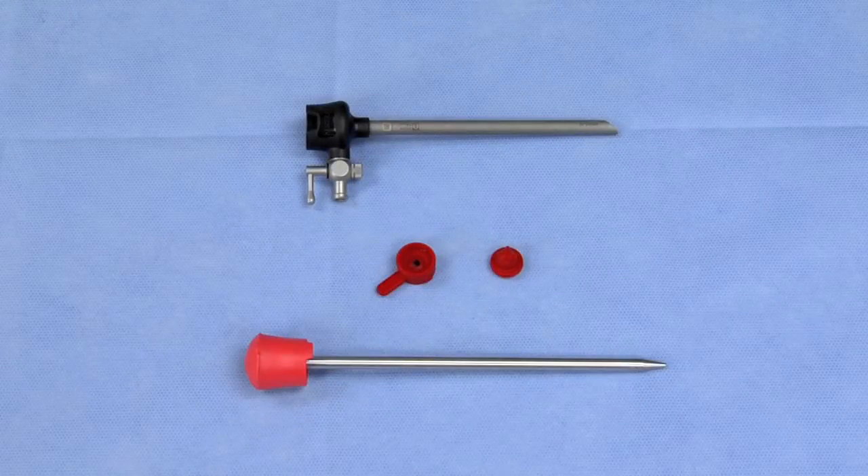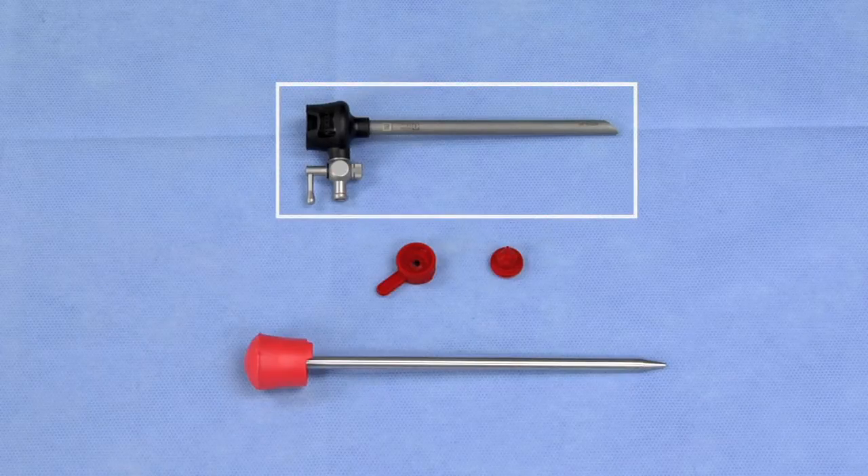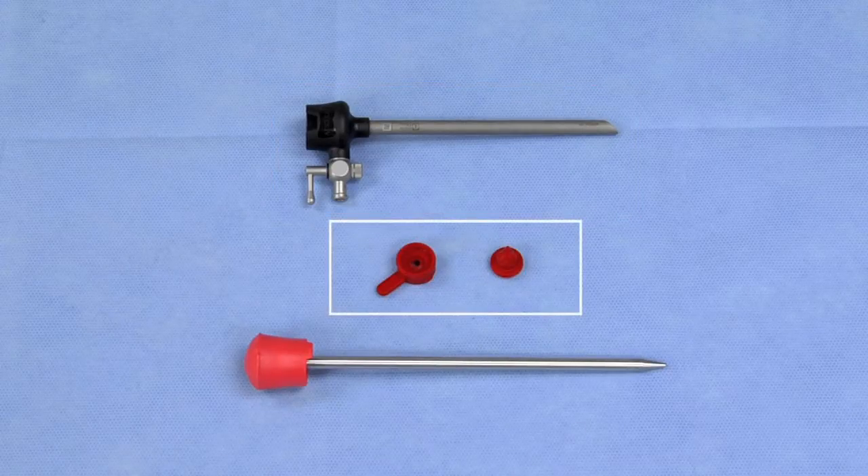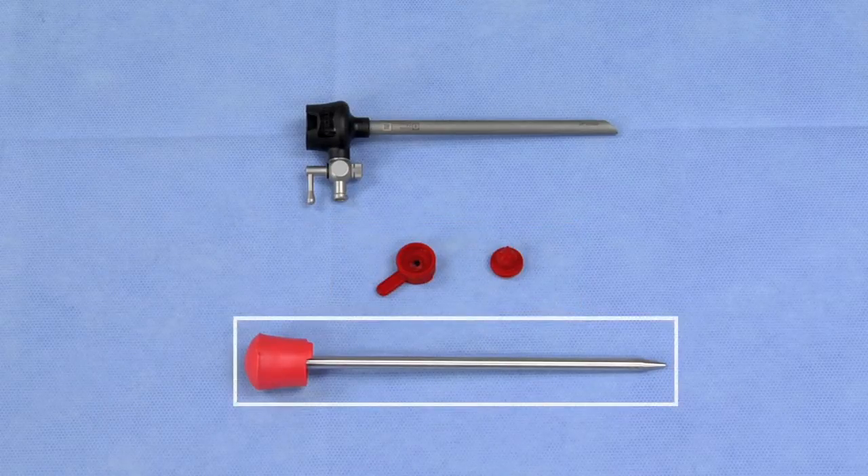Esculap's reusable trocars are comprised of the following components: trocar sleeve, available with and without insufflation stopcock; sealing unit, comprised of top sealing cap and bottom cross-slit valve; and obturator.